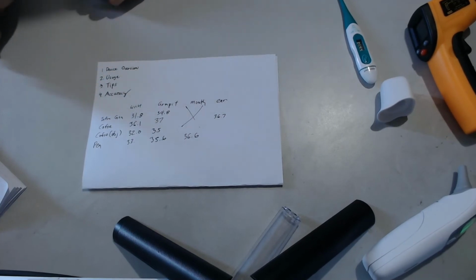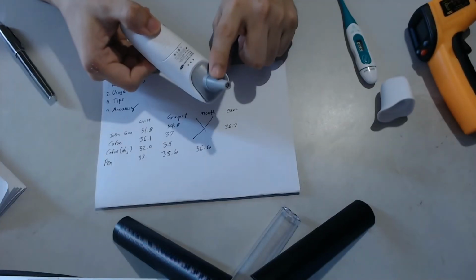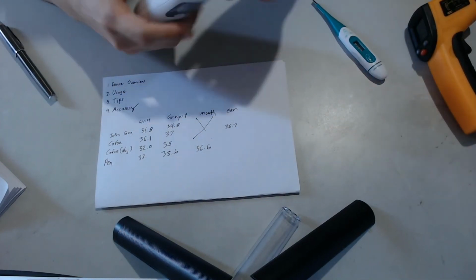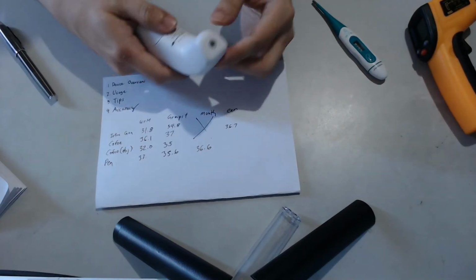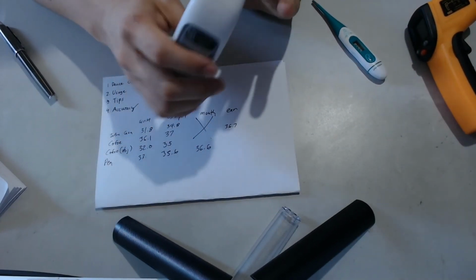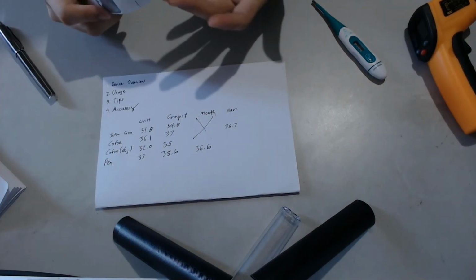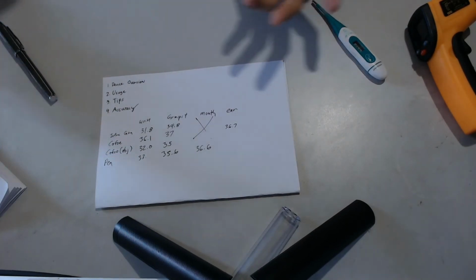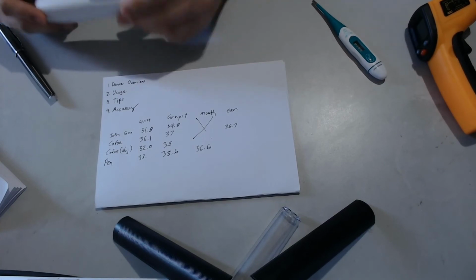So I think this brings me to the other tip. If you can use the ear temperature, measure the temperature of the ear over the forehead. Why? Not that it's more accurate, it's that there's less room for errors. So if you use the forehead, it has to be 1 to 3 centimeters. It's hard to align your forehead with this one. If it's ear, well, there are only 2 holes, and there's only one way to shove it into your ear canal. So there is less room for mistakes.